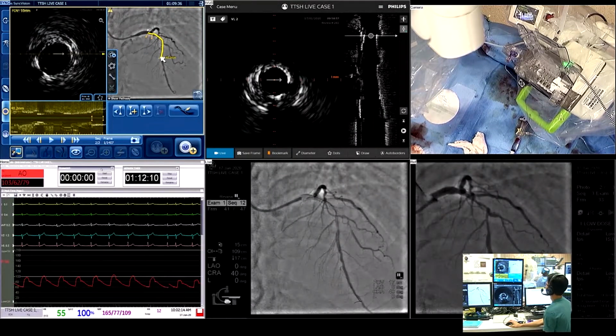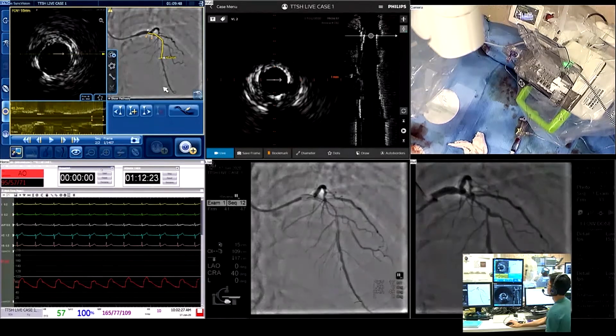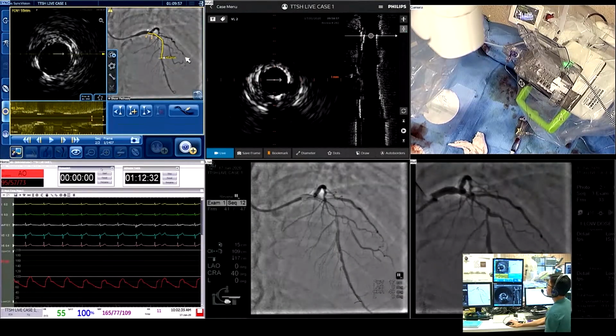34, I think. But on the robotic, if you remember, it didn't really quite come to the ostium of the LAD, so I think I've got a bit of space. So I think 40 is really comfortable. Do you want me to push my luck and go 35? I think most of us will probably go 40, but if it's really tight, I can probably trust the robot a little bit more.